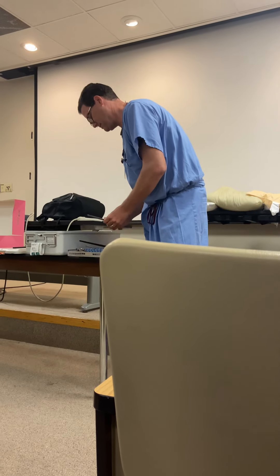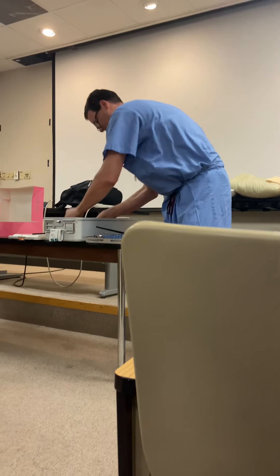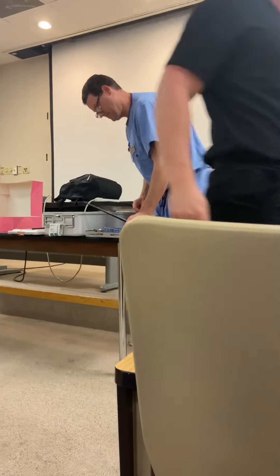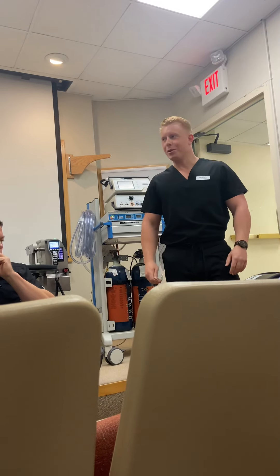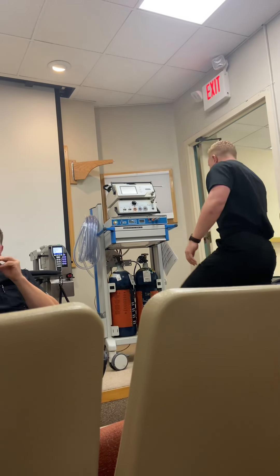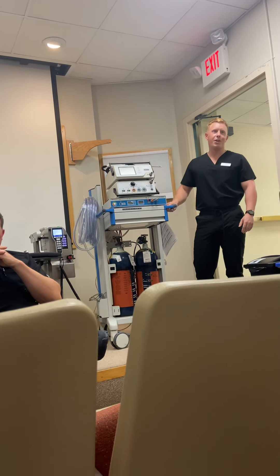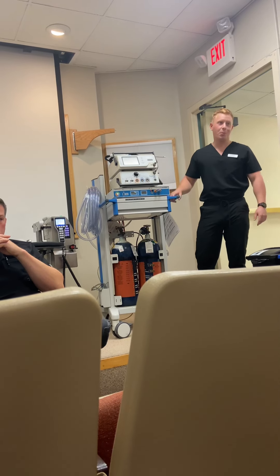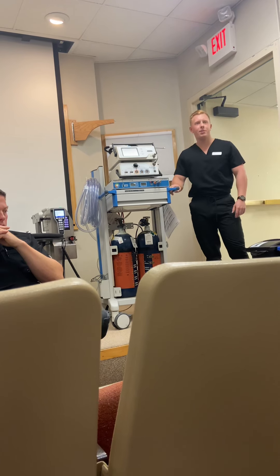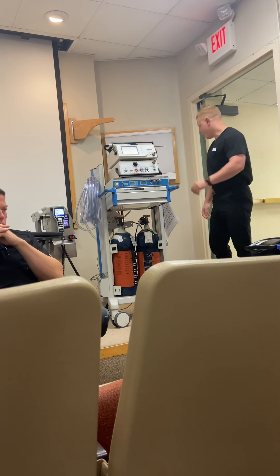Good morning everybody. My name is Justin and I'm one of your local AtYourCare reps. We do the cryo nerve block and the cardiac ablation — I'm also your local donut delivery guy. I just wanted to run through how to set up the cryo machine. It's a really simple machine: you plug it in, plug in the probe, turn on the switch and the gas, and you're pretty much done. I'll run through it step by step.